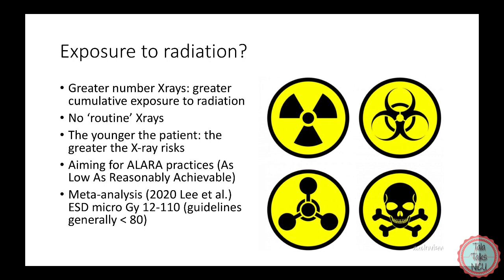Obviously, the other side is many X-rays are life-saving, finding that pneumothorax or effusion or whatever, so we can't stop doing X-rays altogether. What we're aiming for is an ALARA practice, so as low as reasonably achievable. A meta-analysis was published in 2020 by Lee et al., which showed the average radiation NICU infants received during their NICU stay. In the studies, they looked at ESD, or the entrance skin dose of radiation, which was measured in micrograys, and it showed that they had received between 12 and 110 micrograys during their admission.